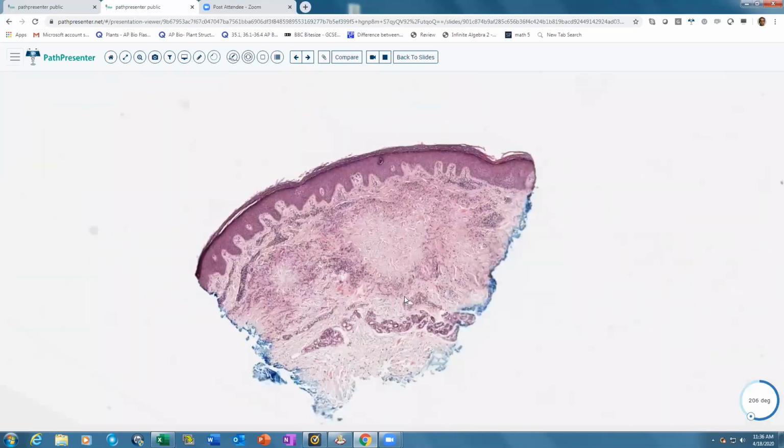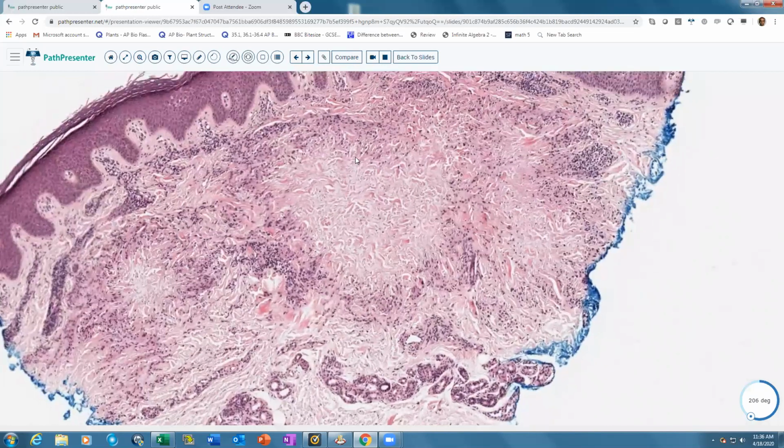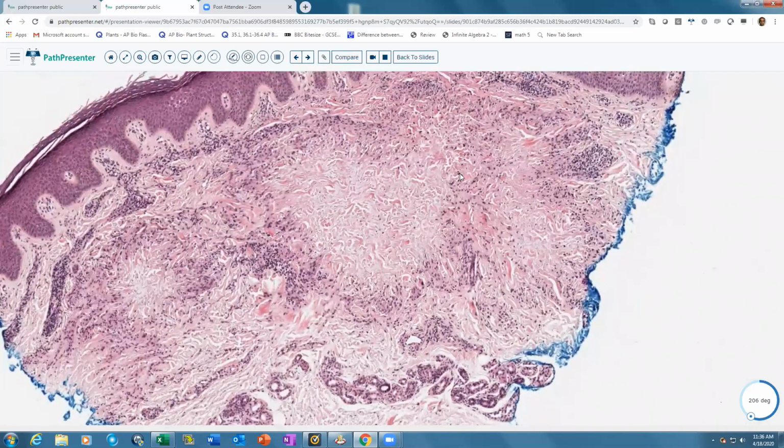Let's zoom in. Again, you see this collection of macrophages and lymphocytes forming a palisade, or a fence, around collagen bundles that don't look as necrotic as we saw in the rheumatoid nodule. Here you can see that the collagen bundles are altered compared to normal collagen on the outside, but they still maintain their outline. This reaction pattern is known as necrobiosis. It's not necrotic, and it is not normal; it's somewhere in between necrosis and normal.